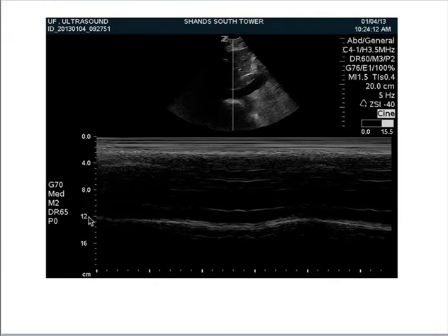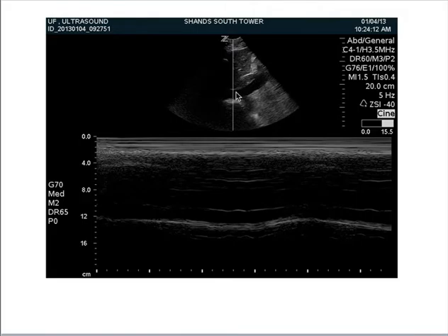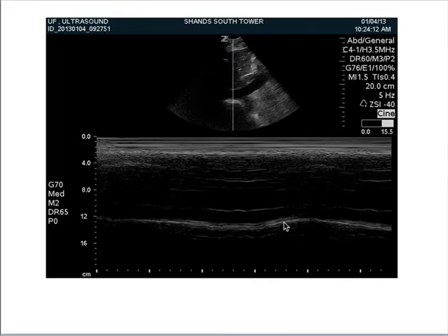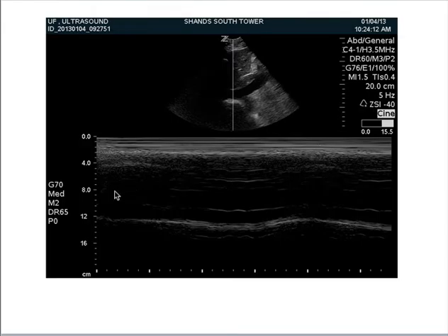Here's a picture of the M-mode. You put the M-mode cursor where you're trying to obtain the IVC measurement — you can place it 1 to 2 centimeters before it enters the heart. You can see the IVC here, and you can actually measure it when the patient takes a breath and when the patient is not taking a breath. You can also look at the soft tissue to help confirm when the patient is breathing.